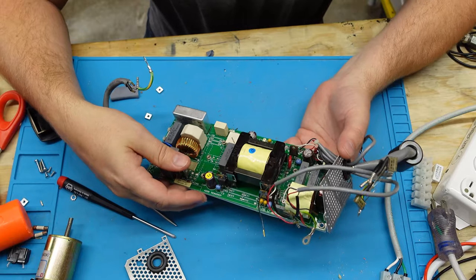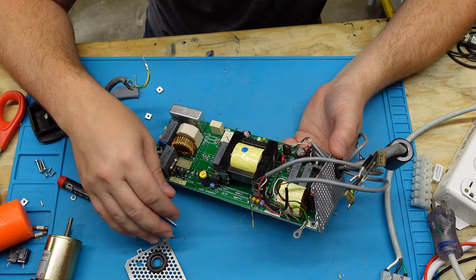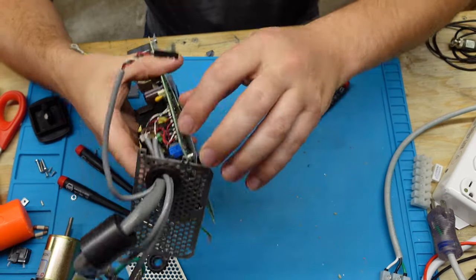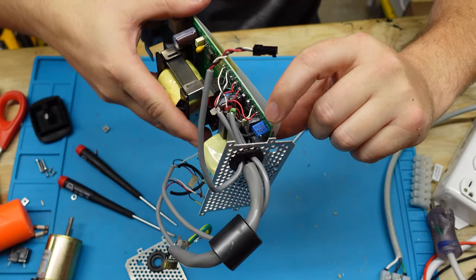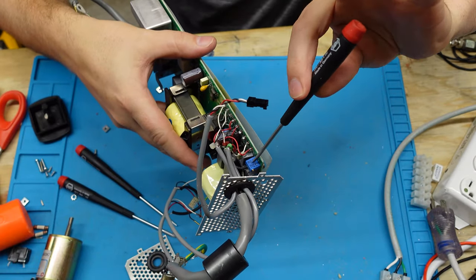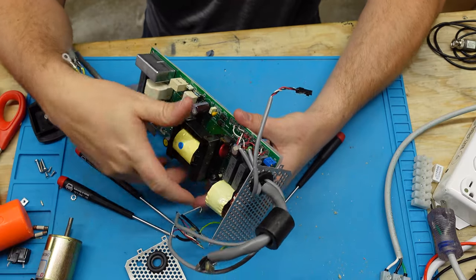And it doesn't smell like brown sugar, because that's a dead giveaway that you've got a bad transformer or something. But right over here, right here in the corner, you can see that there's a little potentiometer right there. And that adjusts your calibration value for the board.